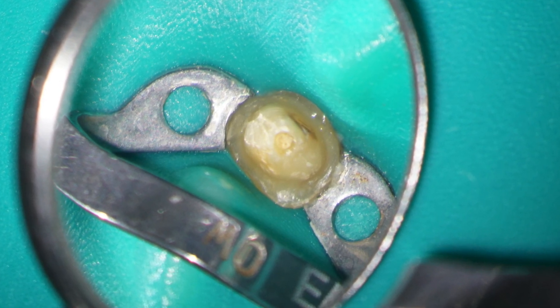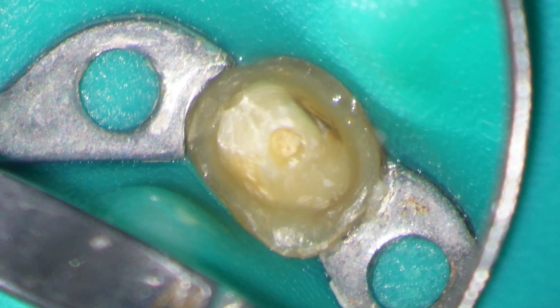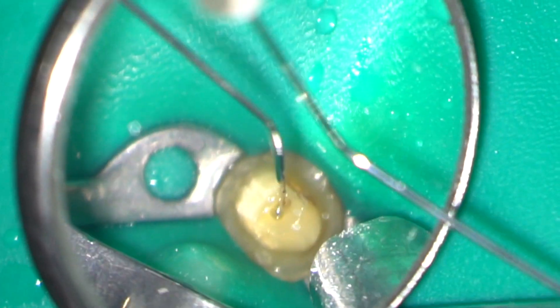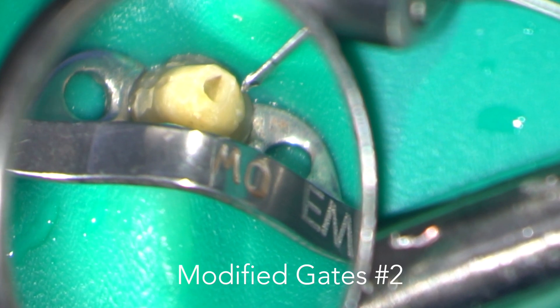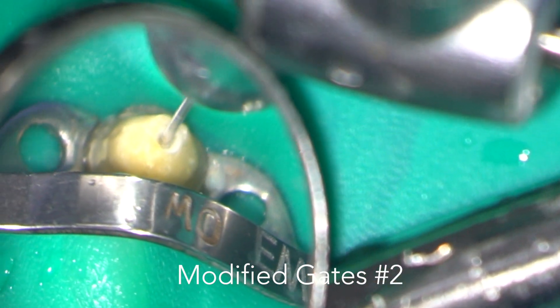The case was referred without any attempt at retrieval of the file and here you can see the small access cavity in the top of the crown preparation. After irrigating with 3% sodium hypochlorite I'm going to use a modified Gates Glidden Burr size 2 to make a staging post down to the head of the piece of fractured instrument.